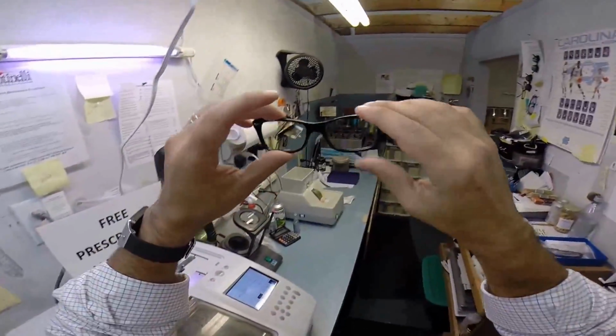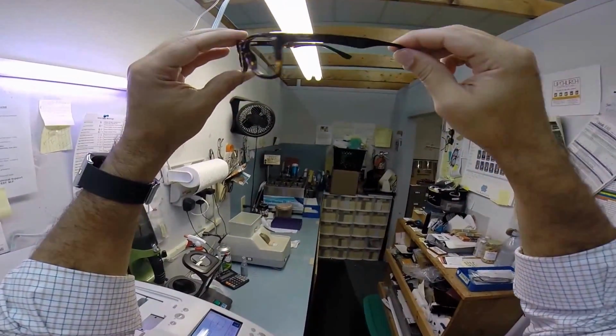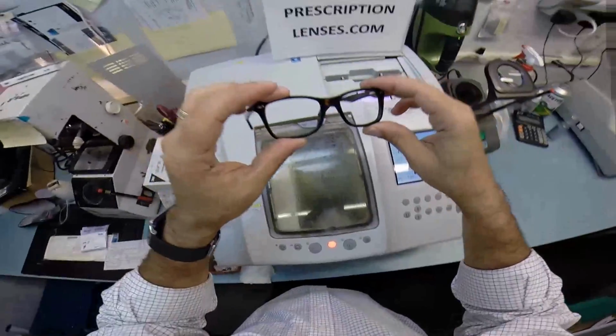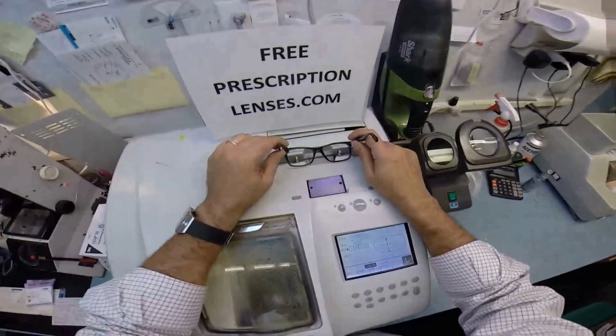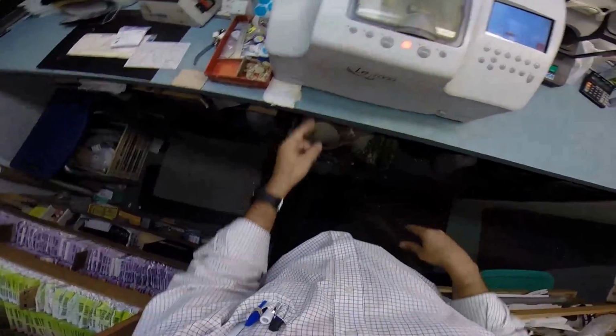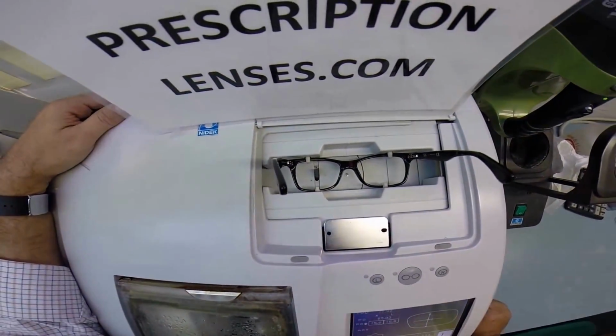You get all the original manufacturer's packaging. And this is the RayBan 5228, and I'm going to hold it up to the light so you can see the tortoise color, because my GoPro camera, being high def still in this lighting, does not show you that when I drop it down here. But I'm going to put your frame into my Santinelli edger. This is the LE1000, and I'm going to trace the shape of the lens.